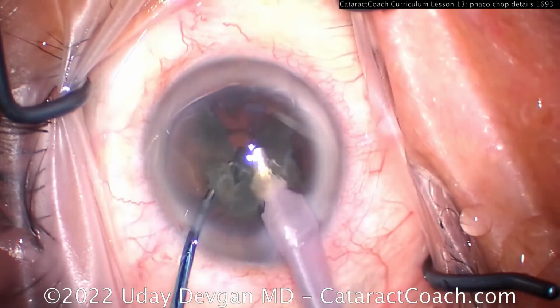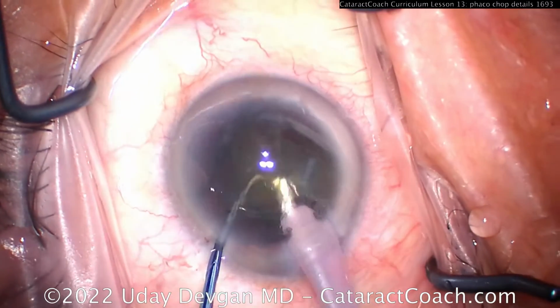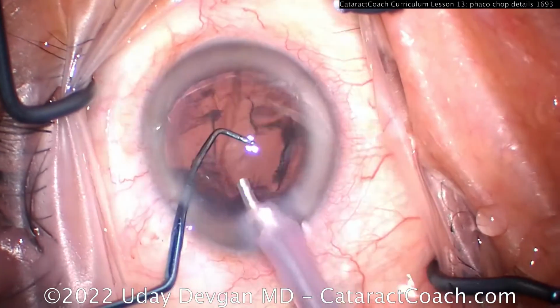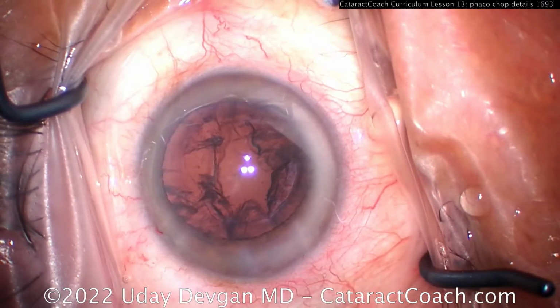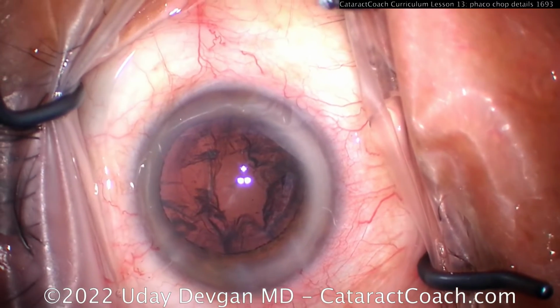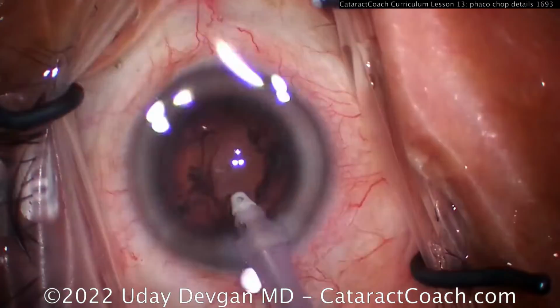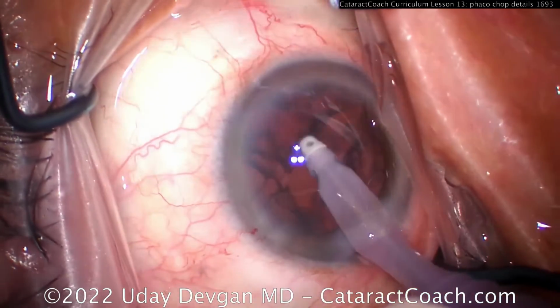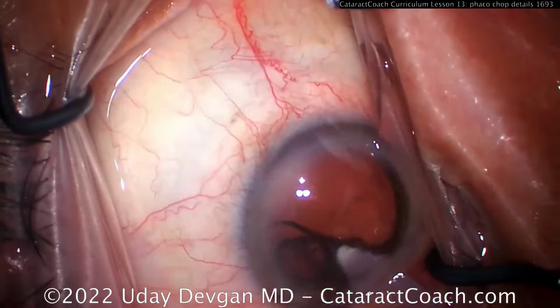Now, the reason I have to have a higher infusion pressure is we're aspirating the fluid out a lot quicker. Look how fast this happens. This video is shown in real time. Yes, in about 60 seconds, the nucleus is gone. Just like that. So in order to operate at this level and this efficiency, I need to have a higher flow and therefore a higher inflow of fluid to make up for that. And so that's the fluidic balance.